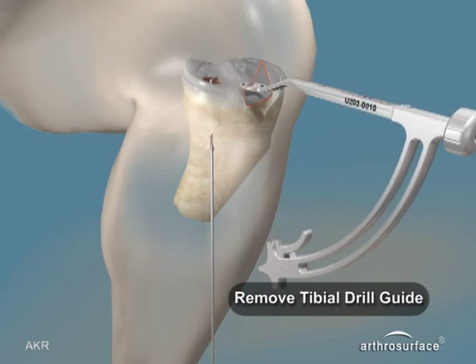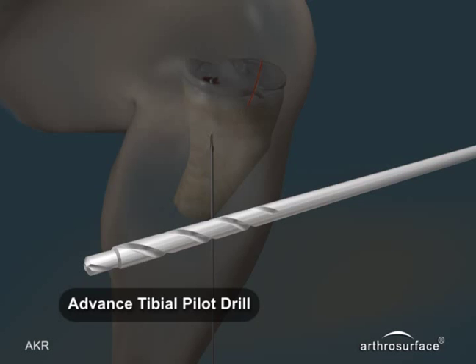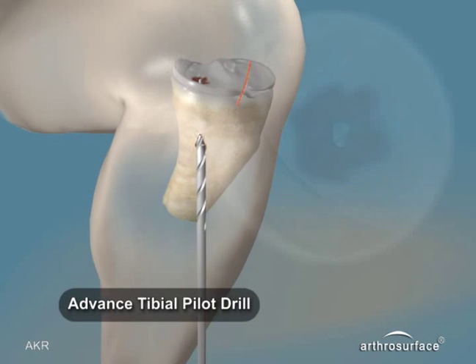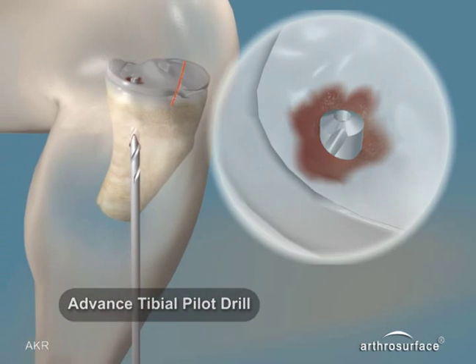Remove the bullet and the tibial guide. Advance the tibial pilot drill over the guide wire and through the tibial plateau. Be sure to avoid reaming into the femoral condyle, then remove the hardware.